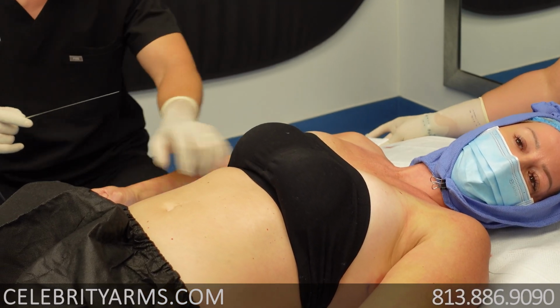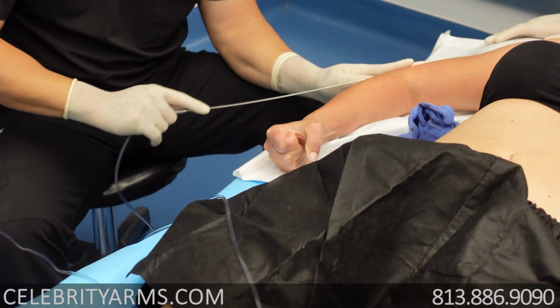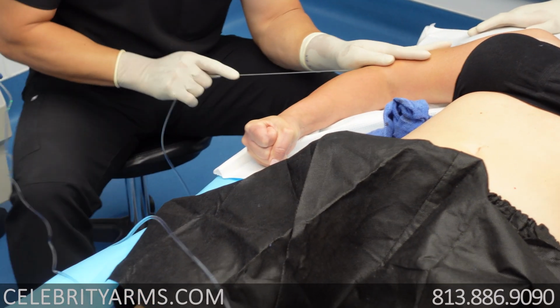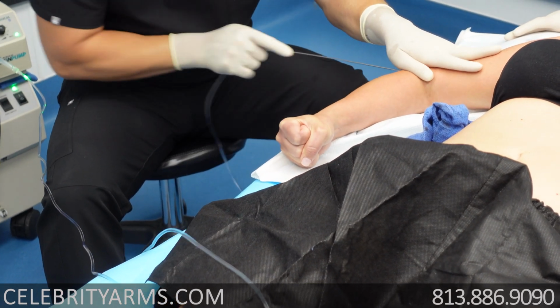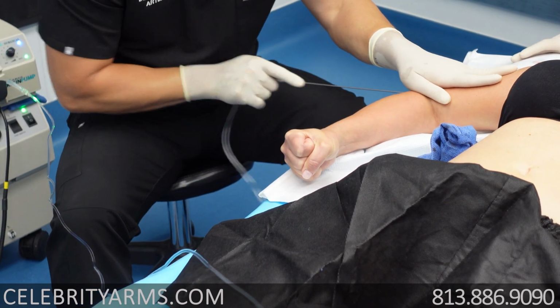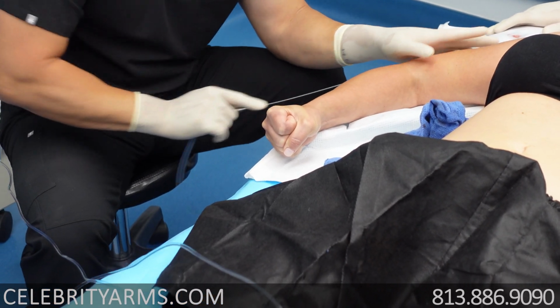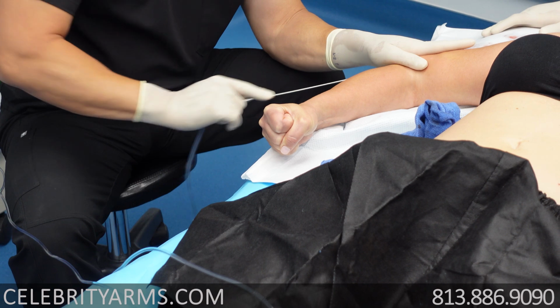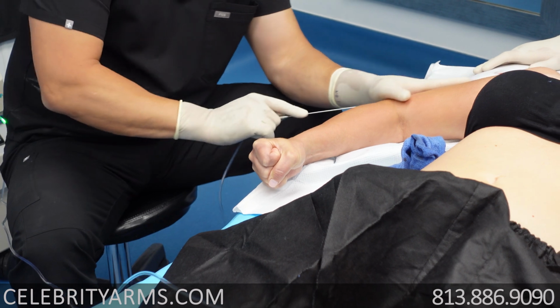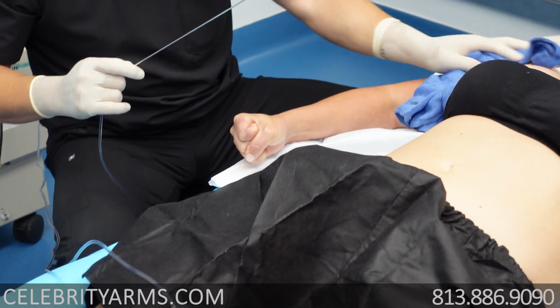Hold it right here. Okay, so I don't know if you can tell, but she's got her arm tense like this. Again, this is just for control and sake of accuracy, because as I'm moving back and forth here, I'm in a fairly thin layer, and I want to make sure that I'm traveling that layer very smoothly and that I'm not going to be all over the place. I want the fluid to be distributed in a very smooth fashion.